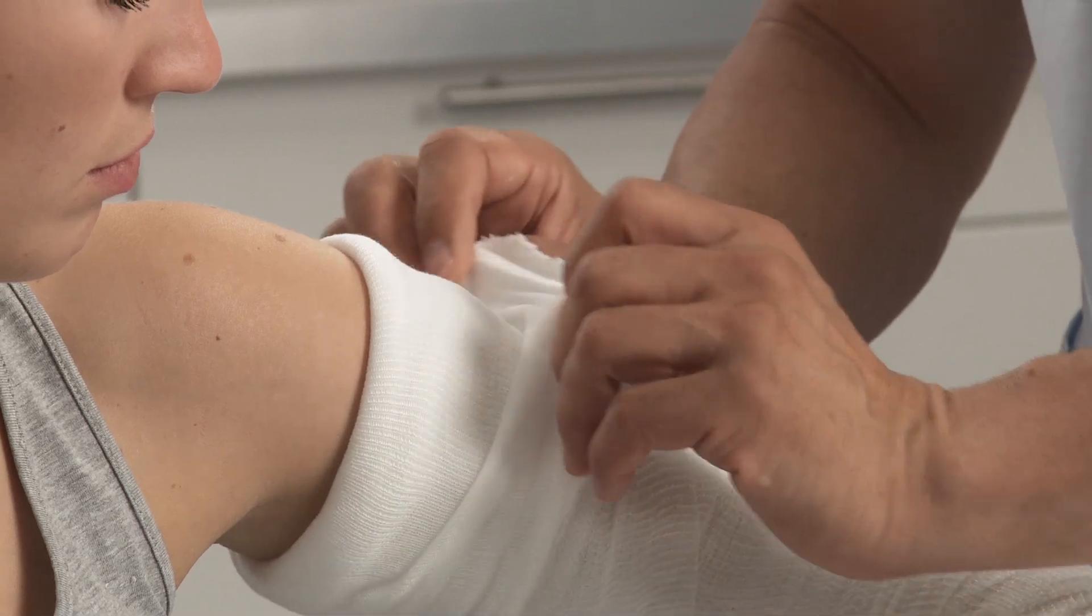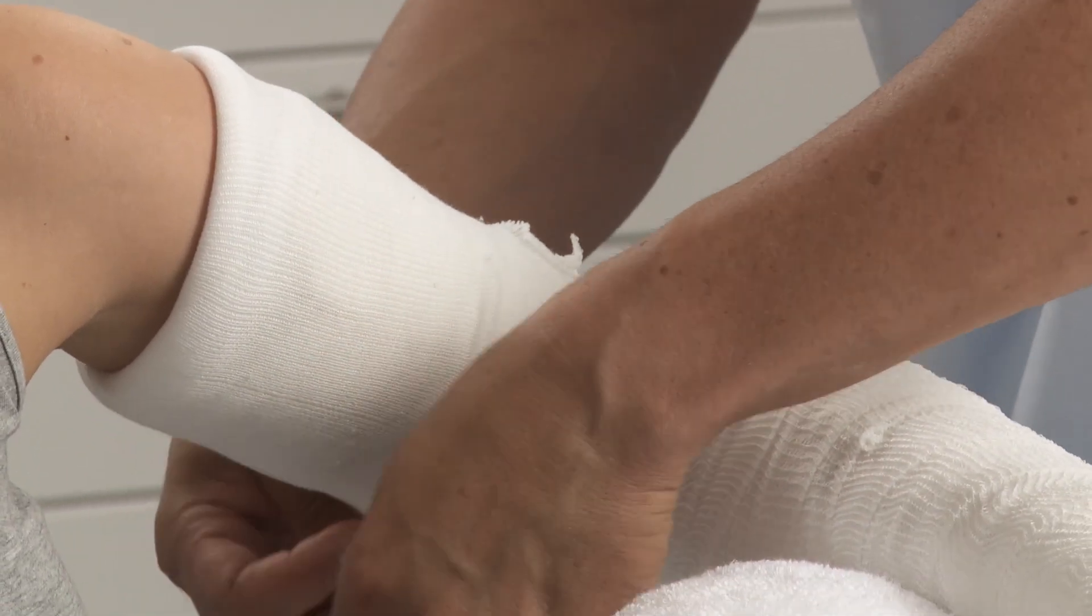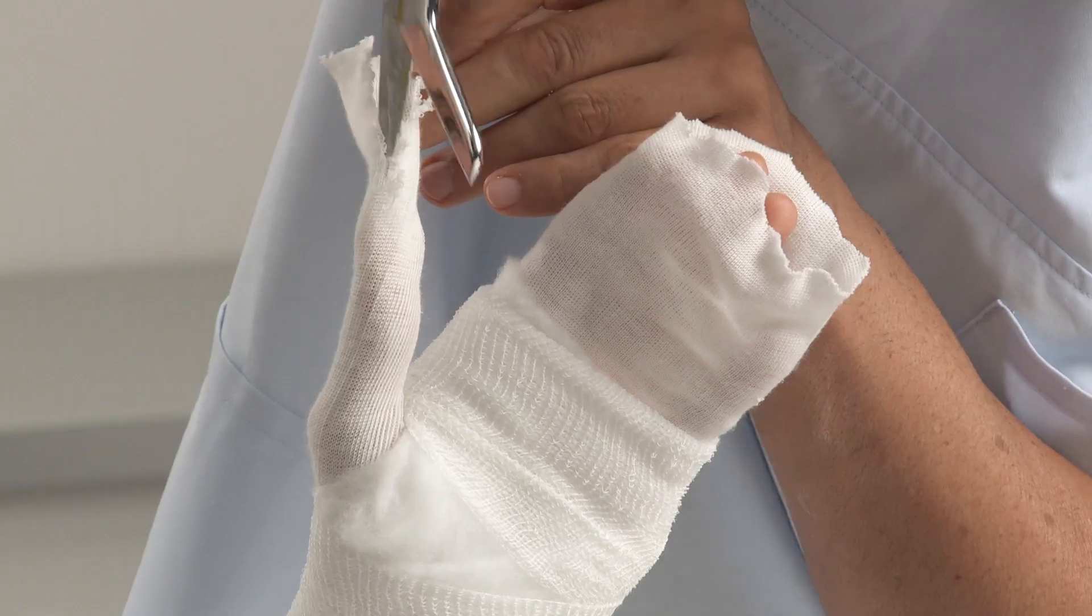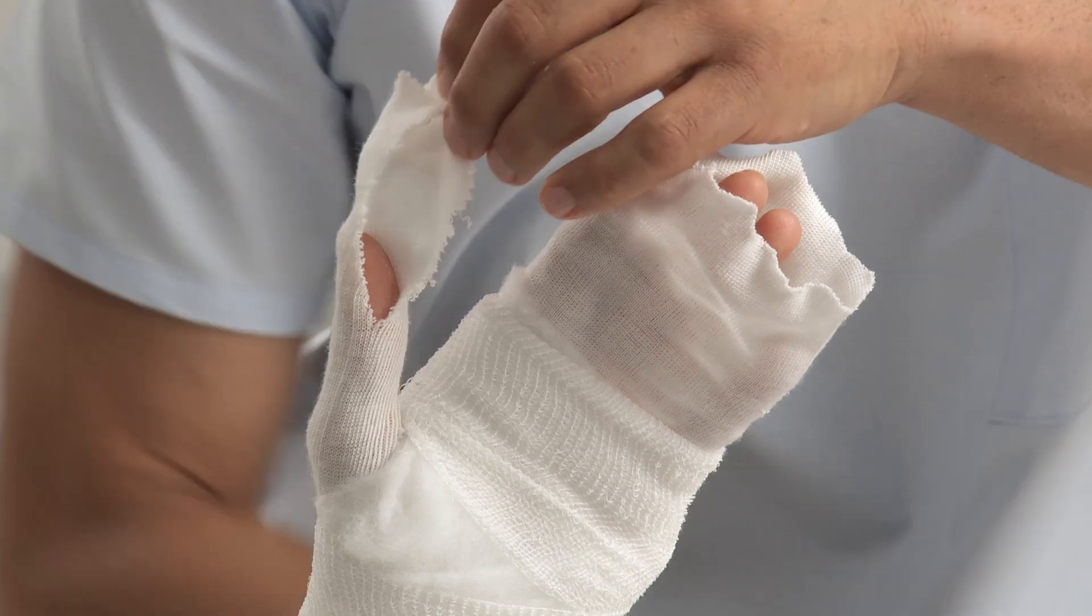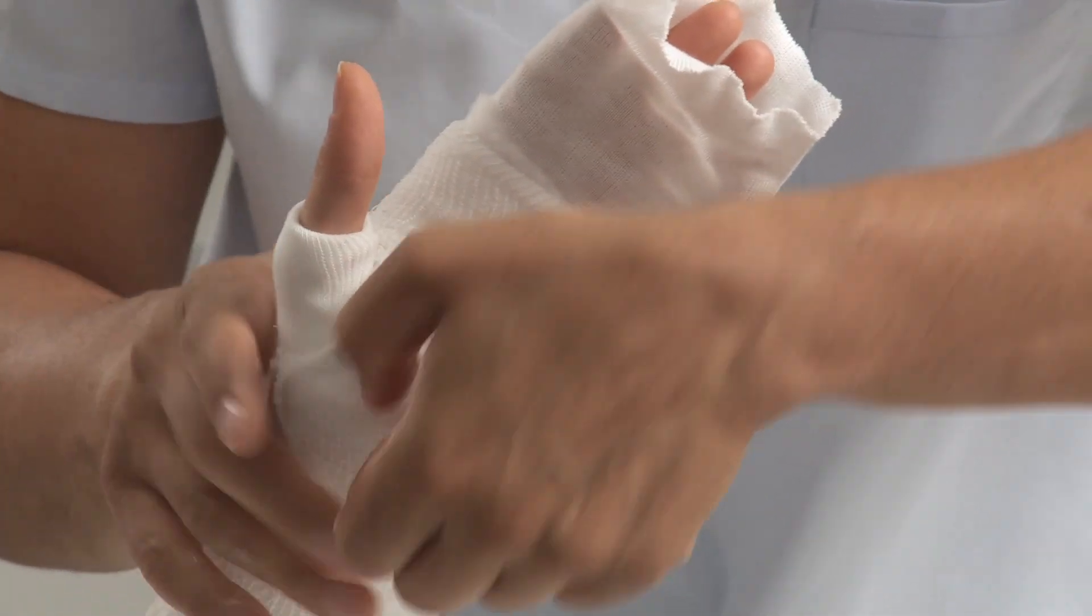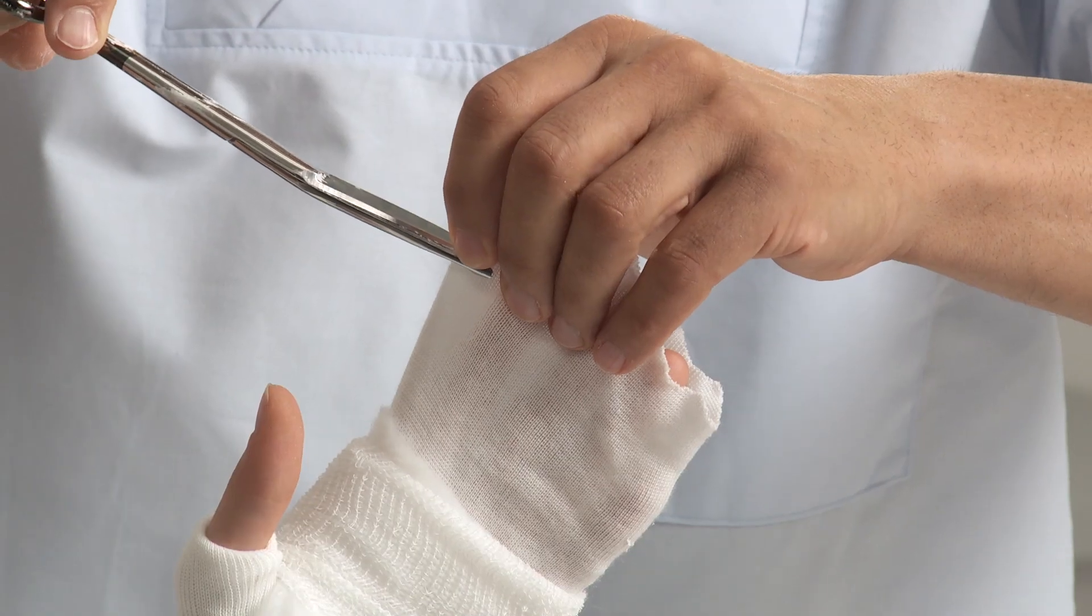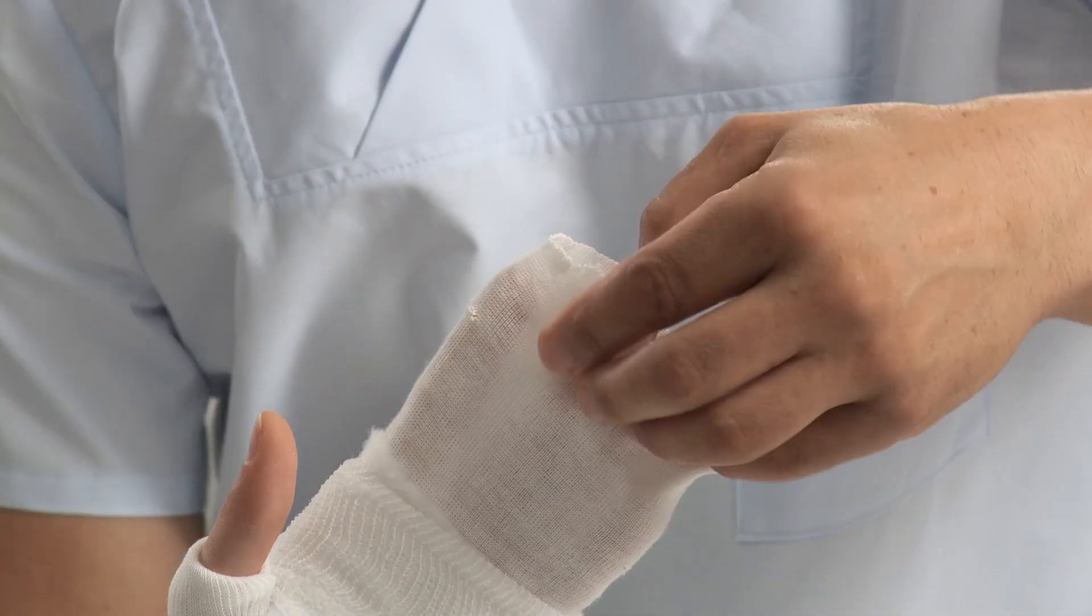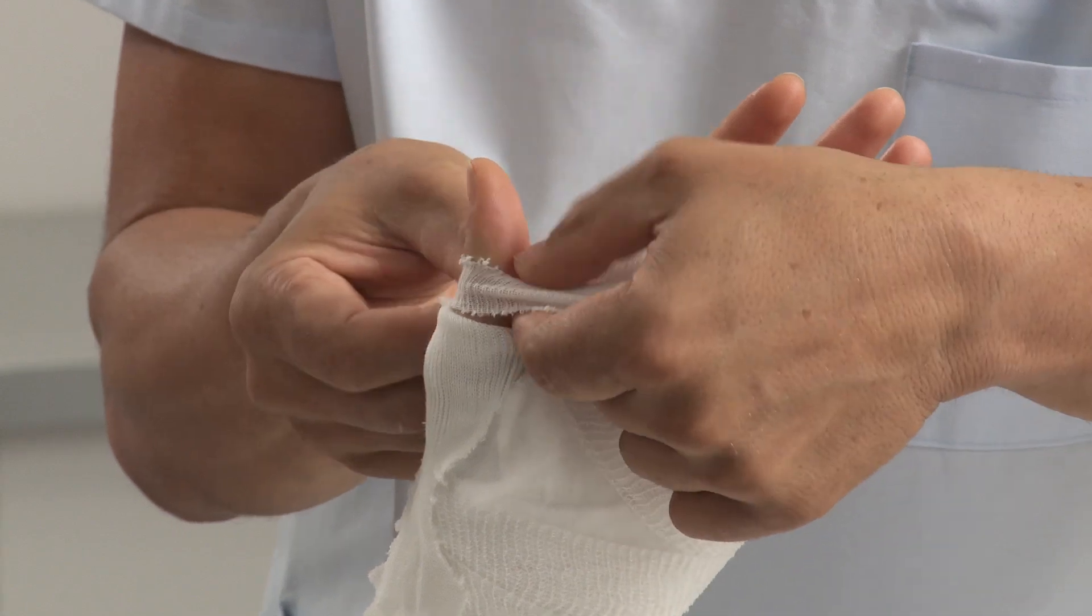Fold down the arm stockinette at the proximal end. Cut into the thumb stockinette and fold down. Make a small cut at the distal end of the arm stockinette. Fold it down and pass the thumb through the cut.